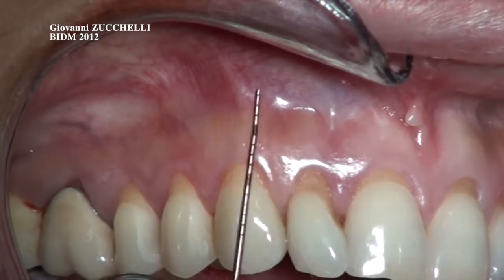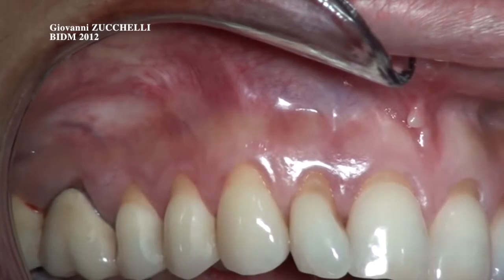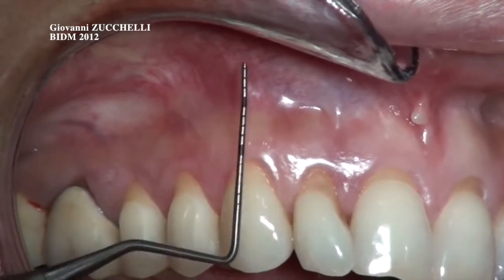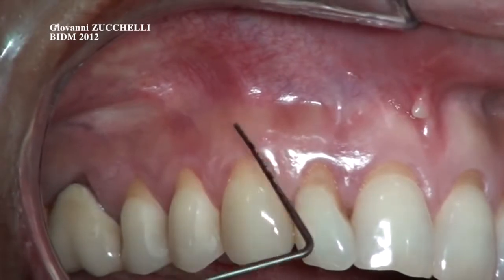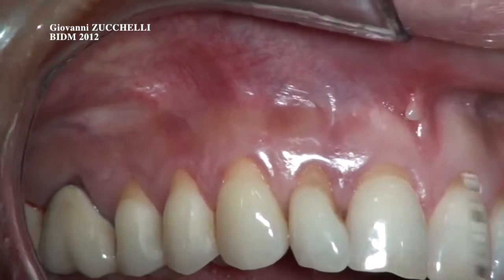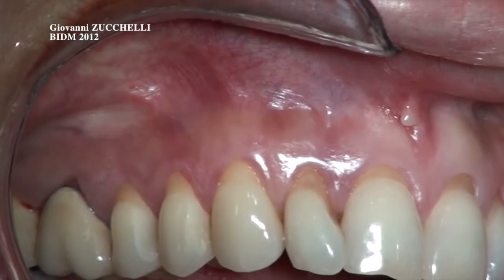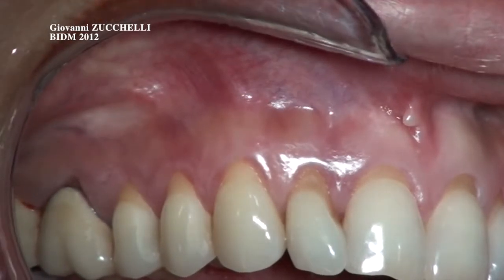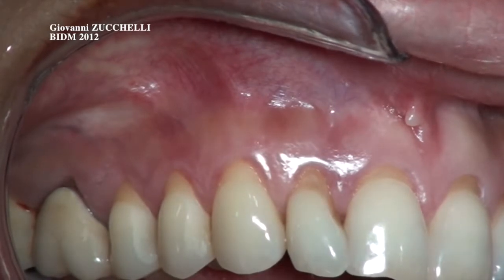In this envelope type of flap, all the papillas, which are called surgical papillas, that I'm going to design and dissect, will rotate towards the periphery of the flap, which is the central incisors and the molar. So I'm going to place the surgical papilla in such a position in order to predetermine the movement they're going to make during the coronal advancement.